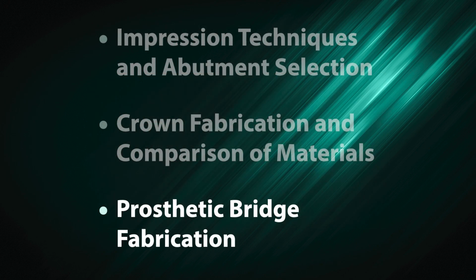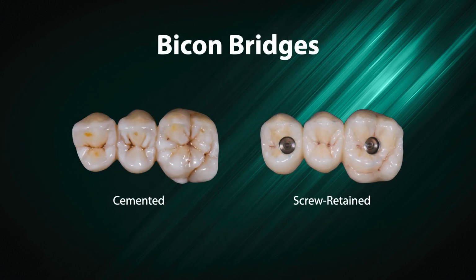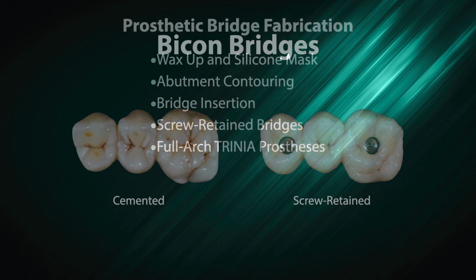Prosthetic bridge fabrication. Bicon bridges. On the left are Bicon cemented bridges, and on the right are Bicon screw retained bridges.